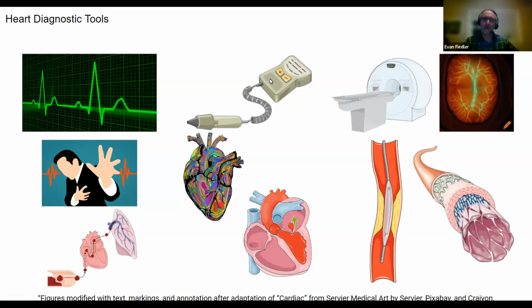This is representing ultrasound. And when we use ultrasound, an echocardiogram, this instrument is specifically Doppler ultrasound, but if we use an echocardiogram with Doppler ultrasound, we can look at cardiac volume. I thought this was an interesting image with all the different colors in here. So cardiac volume, which will then give us an idea of cardiac output. But we can also see structural defects, and you can see there's a structural defect here in the mitral valve because the blood should be flowing from the left ventricle into the aorta, and we see it's now backflowing.